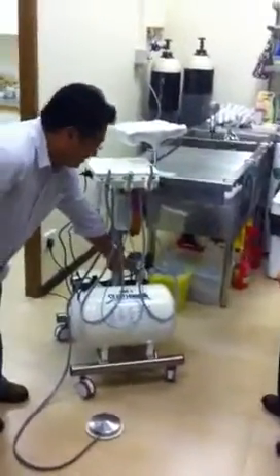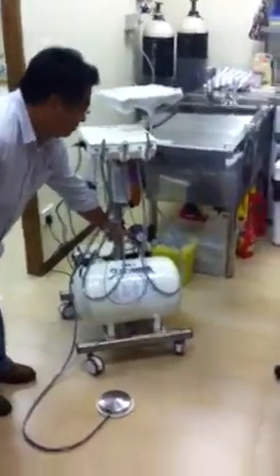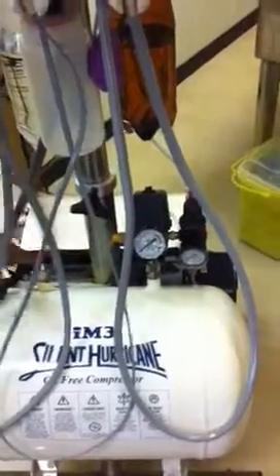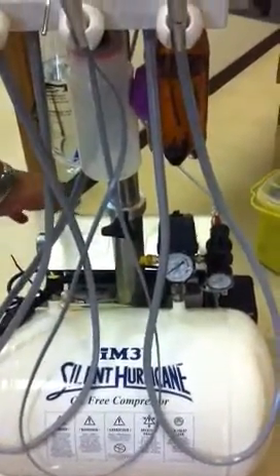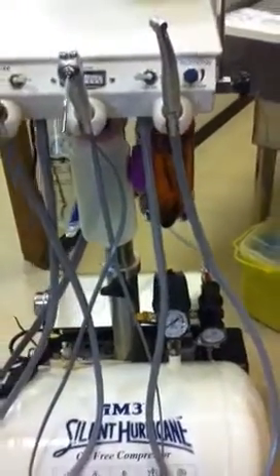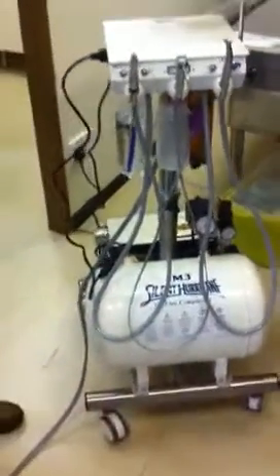This is your direct pressure gauge, straight from your instrument. Generally, this should be kept between 90 to 120. But not to worry about it. It just basically measures the output pressure from the compressor into the air tank. So basically what happens is if the pressure in the air tank reduces to 70 psi, the compressor will kick in and pressurize it up to 120 again.